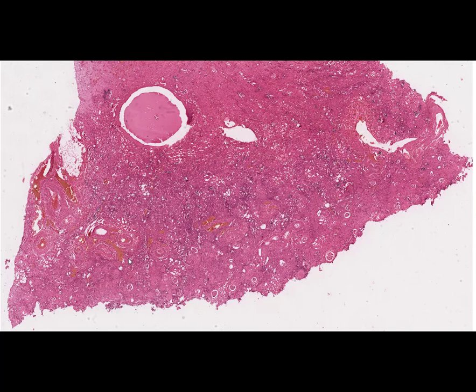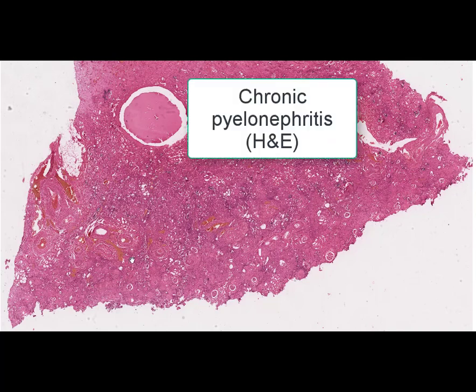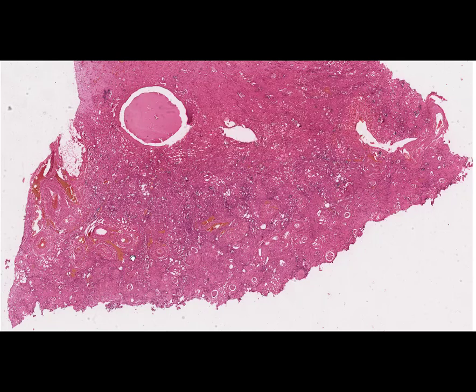On this slide again we can see a kidney, stained by hematoxylin and eosin. The name of this slide is chronic pyelonephritis. In contrast to glomerulonephritis, pyelonephritis is an inflammation of the pyelocaliceal apparatus and tubular-interstitial component of kidney parenchyma. Generally it is caused by infections.